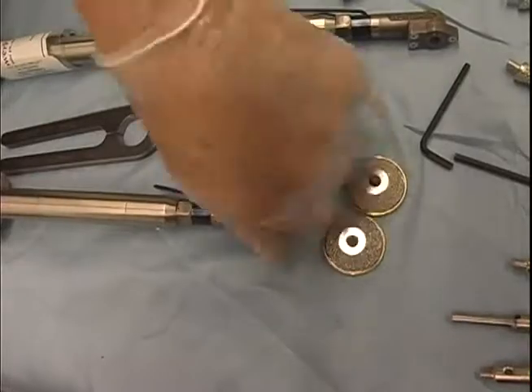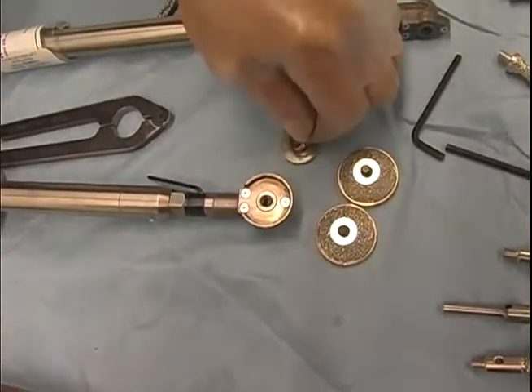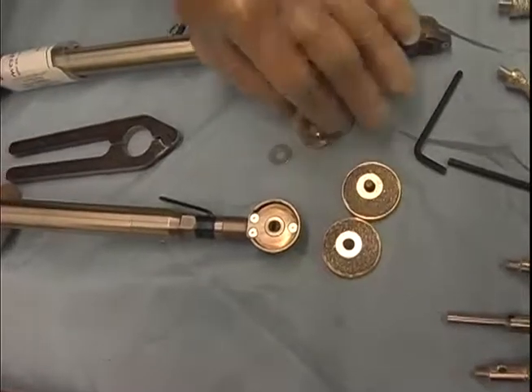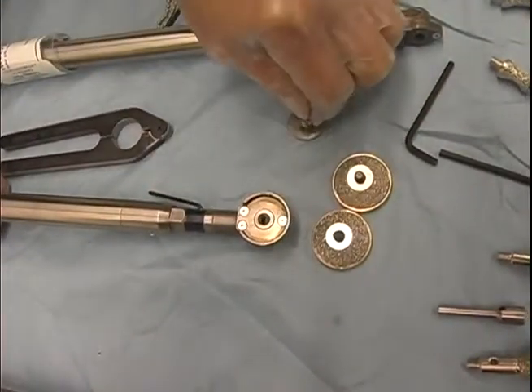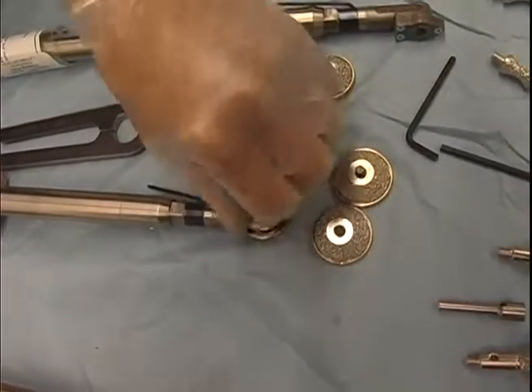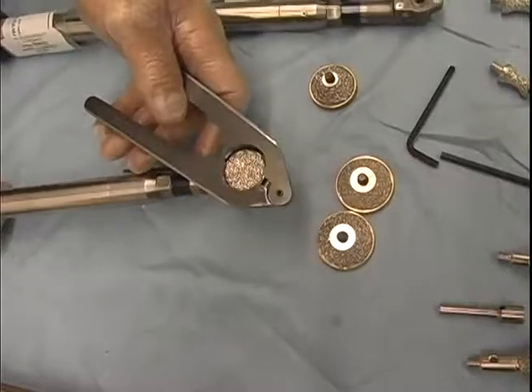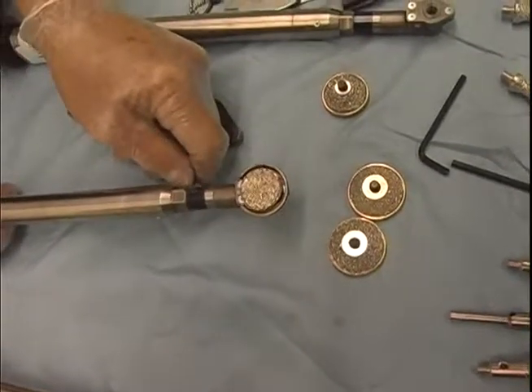You take the wheel off, and put a new wheel on. You simply thread it in. All of these wheels must have a washer between the grinding wheel and this point right there. The washer and a new wheel is put on simply by turning it on finger tight. You can give it a little more tightness with the wrench, but it's not particularly necessary.